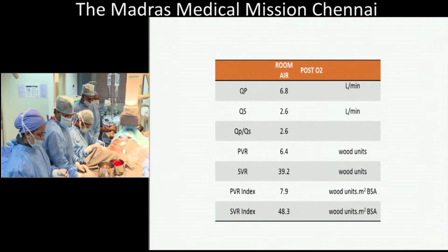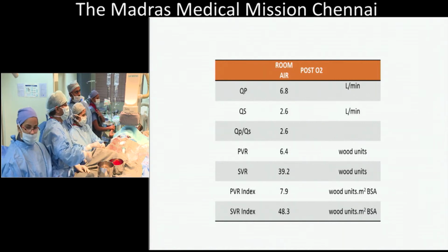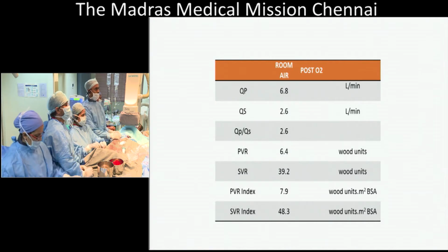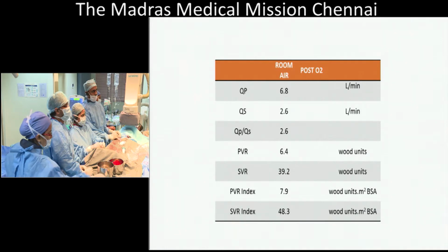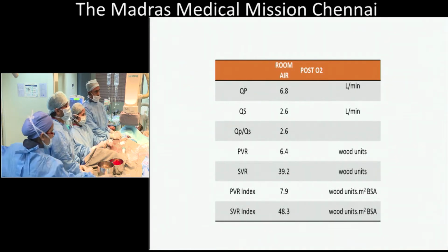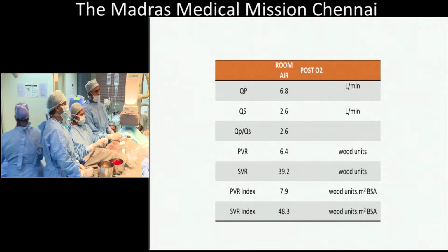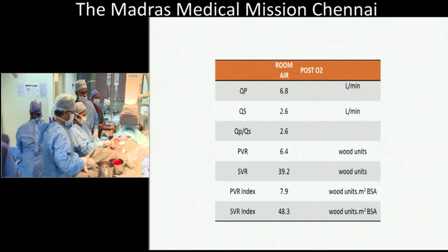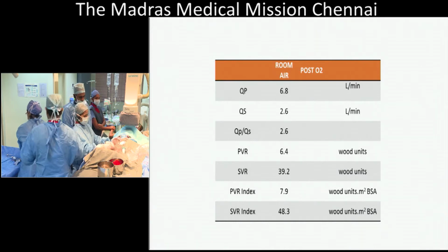In my opinion, a fenestrated ASD device helps only in those patients who develop high LA pressure following ASD device closure, who have a high LV pressure, with a large ASD. The fenestration helps them in reducing the LA pressure and preventing immediate post-op pulmonary edema, but not in such cases. In these cases, either you decide to close or not to close. If you decide to close, it's a regular ASD device closure. I will go for regular ASD device closure. Okay. Regular.